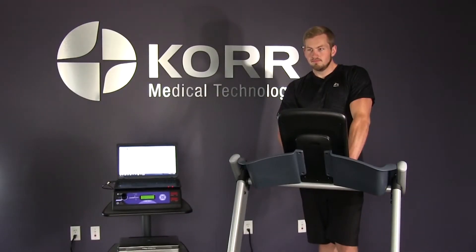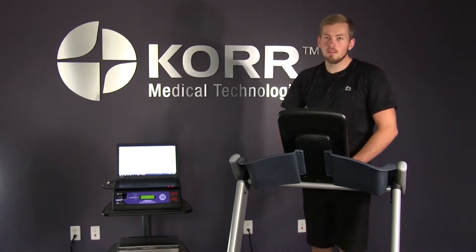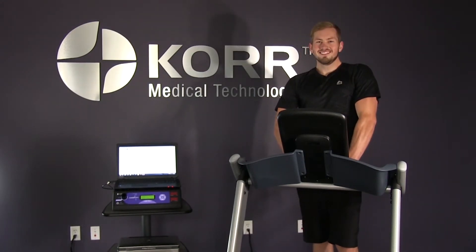Prior to performing exercise testing, it is extremely important that you talk to your client about their current fitness level. Take the time to sit down with your client and discuss at what speed and incline they are comfortable running or walking, as well as previous injuries that might affect their performance level. Knowing your client's fitness level will help you determine the proper protocol for their test. Your CardioCoach is running and your client is already fitted with the heart rate strap — let's begin the actual test.